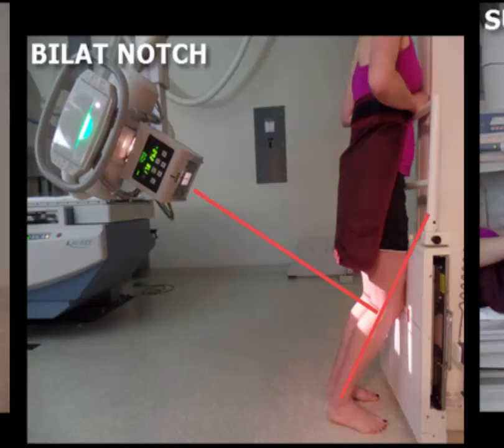Here, in this particular notch view, the patient is standing upright. They're resting their thighs up against the upright bucky and holding on to the support bar. The feet have been placed several inches away from the upright bucky. This can be a semi-comfortable position for the patient, and we want to have the knees kind of flexed approximately 45 degrees. However, some patients will only be able to handle 20 to 30 degree flexion.